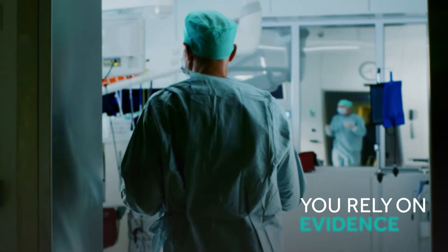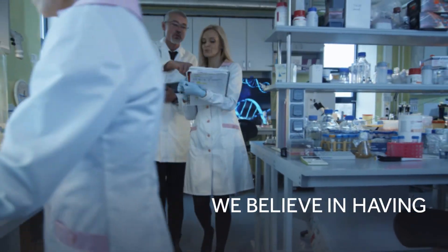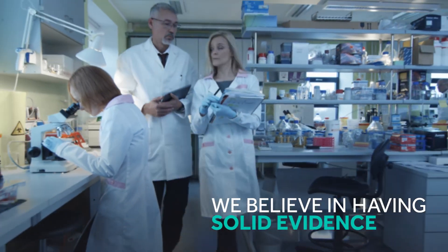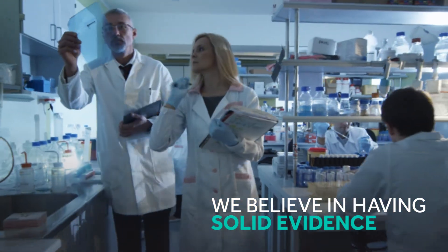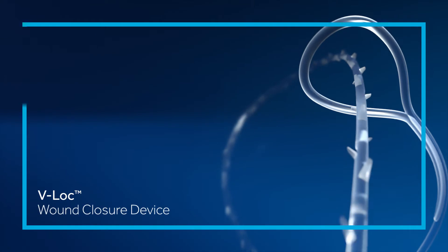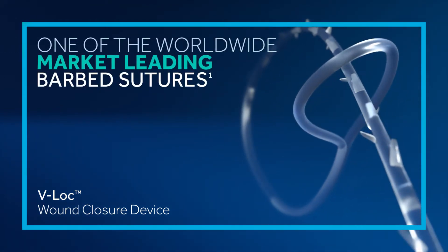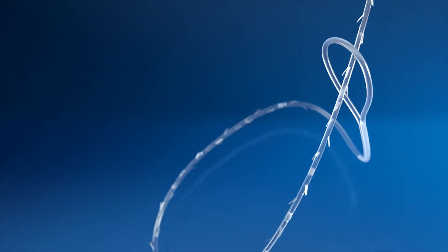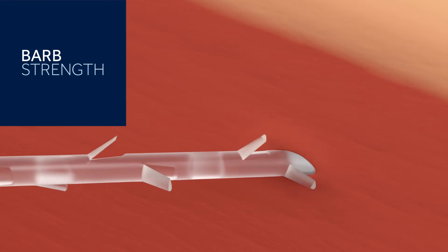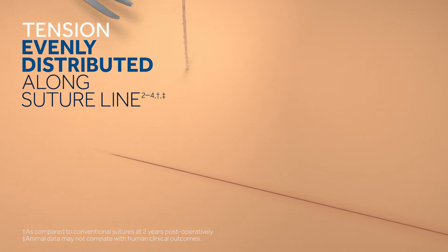You rely on evidence. We believe in having solid evidence that supports everything we say or do. So we put our V-Lock Wound Closure Device, one of the worldwide market leading barbed sutures, to the test. And the evidence is clear. The device's barbs securely approximate wound edges and distribute tension evenly along the suture line, without the need to tie knots.